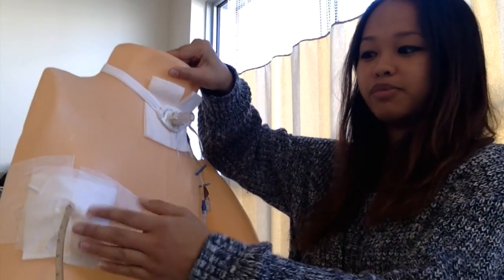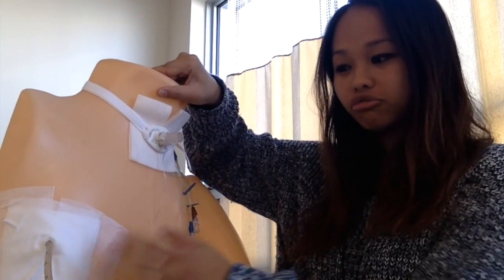continue. Afterwards, if there aren't any other concerns, I'm going to move on and do a chest tube assessment, starting with the dressing up on the side. It's like so on my mannequin, just making sure that's intact, there's no drainage or any pain, and if there's any pain, I'm going to be willing to ask the patient if they want any PRNs or other means of comfort. Afterwards, I'm going to check the tubing and make sure all the connections are intact, if there's any holes, or if anything's loose or anything's draining from any point of connections.